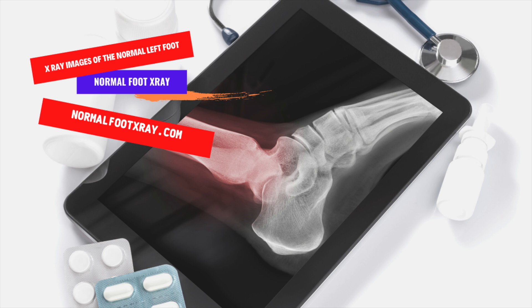The X-ray images of the normal left foot can sometimes be ambiguous, so a video of the foot can help the physician determine whether the foot is normal. A video of X-rays of a normal left foot is available for further comparison. The X-ray images of the right foot are also useful in assessing the alignment of the metatarsal phalanges.